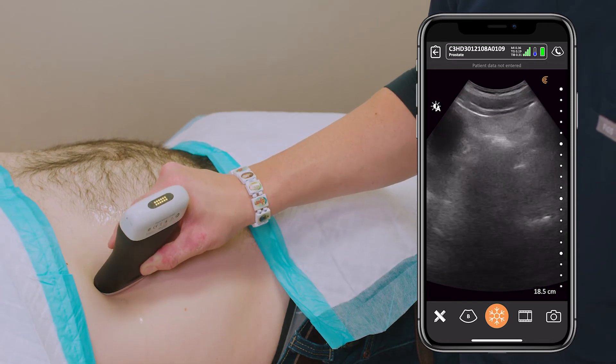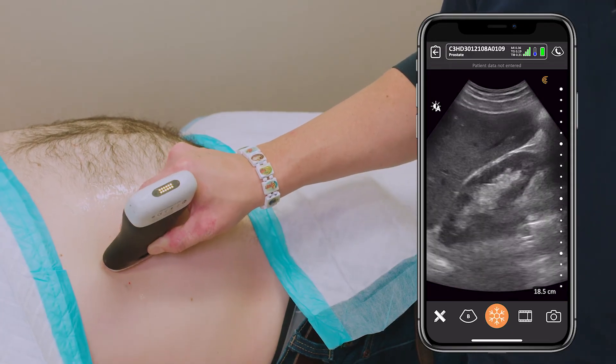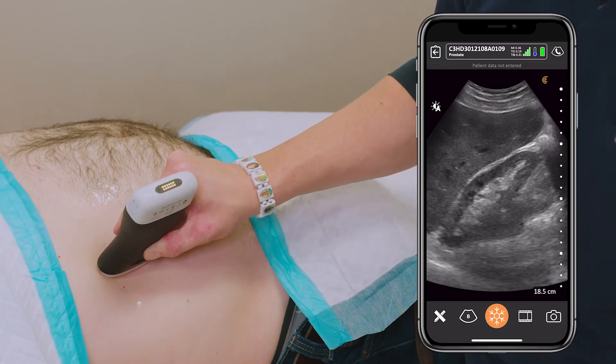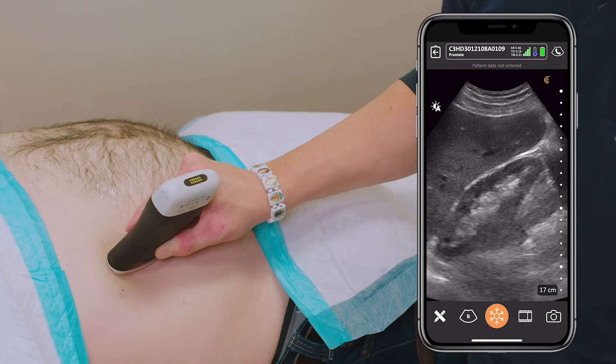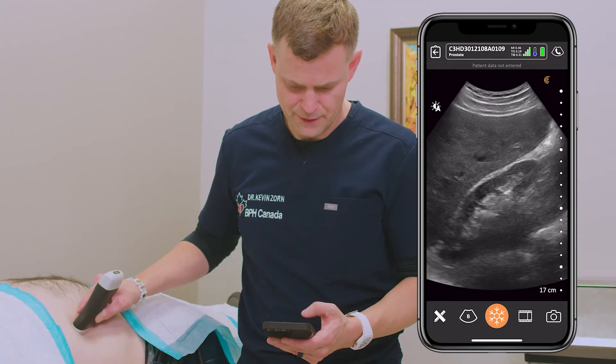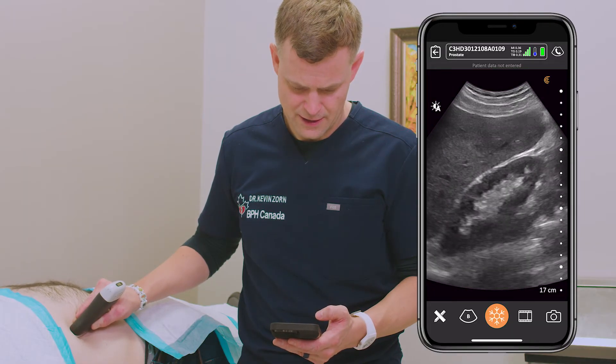Following the kidney — there's our patient's right kidney. We'll lower it a bit. So we're looking at the midsectional view. This is the renal fat, the sinus, and the central portion. Seems normal.